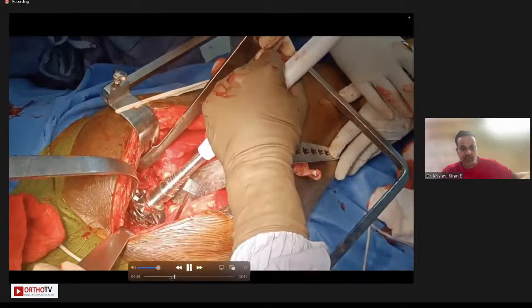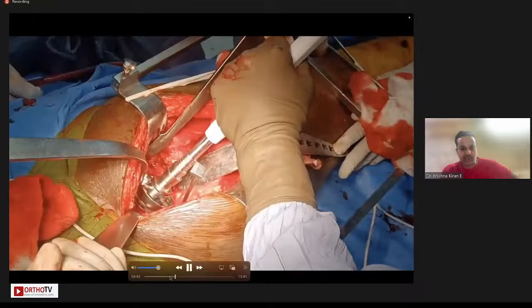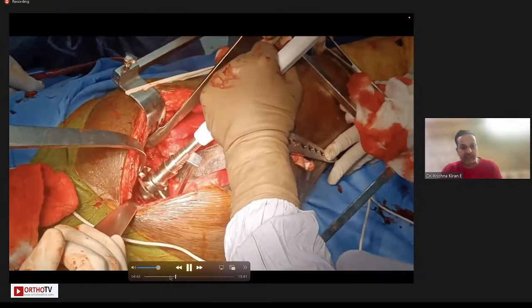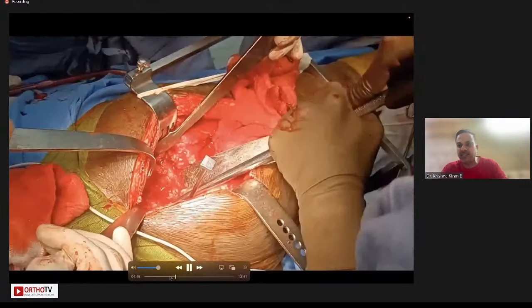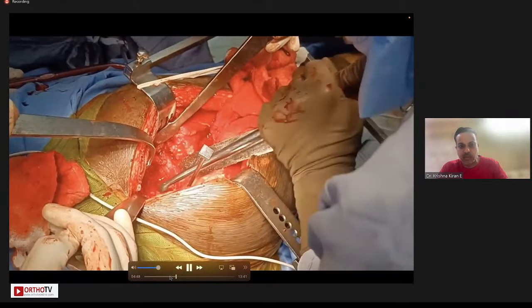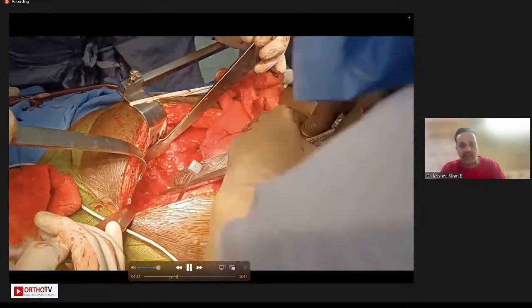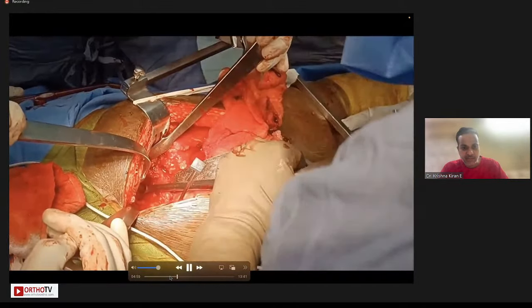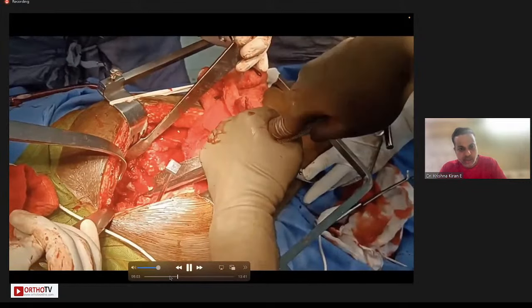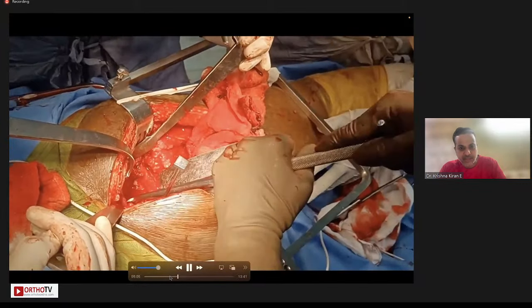So the key step here: identify the superior pubic ramus, keep reaming in reverse so that you don't remove too much bone aggressively. And once the correct size appears, the reamer will just disengage from the drill. And that will give us an idea that we have now achieved a two-point contact. So that is the provisional size of the socket we are going to employ in that particular patient. And whenever there is a significant superior defect, from here in this case, from 10 o'clock to 2 o'clock position, there is a big defect there. And that defect we are managing using an augment.